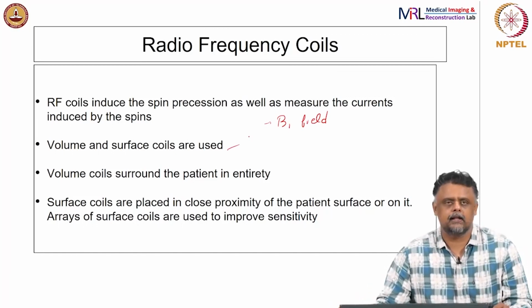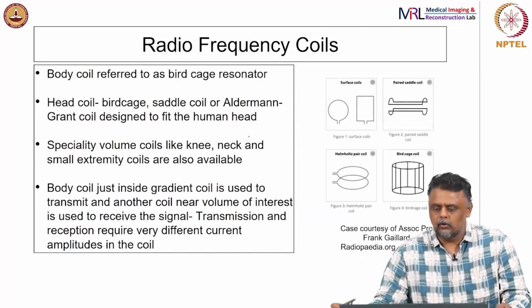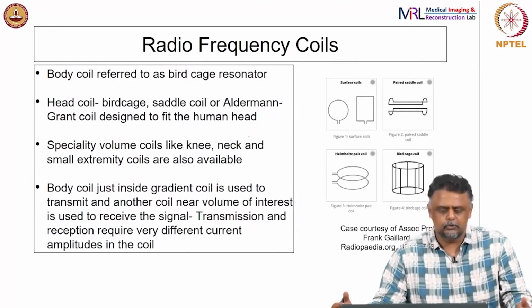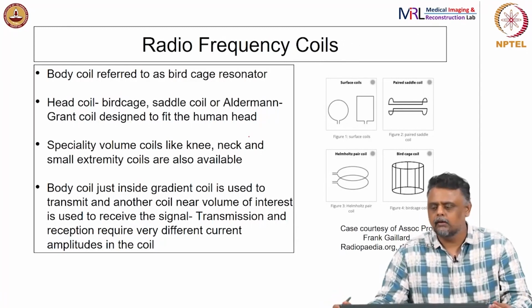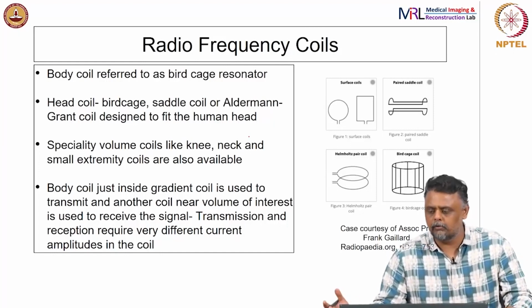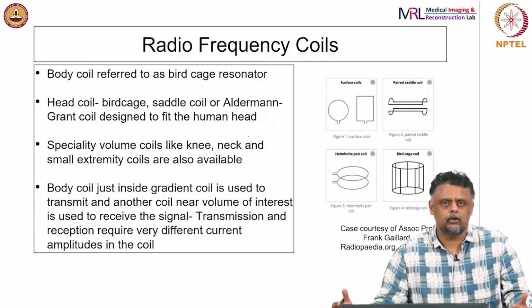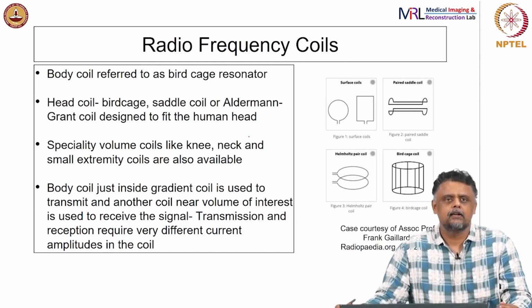Once again this is one of the hardware challenges in designing an MR scanner, right. The radio frequency coils come with different configurations. I have listed some of them here. If you are into RF transmission, etc., you should read up more about how to design these coils, what each one of them produces, and how the acquisition electronics work, right.